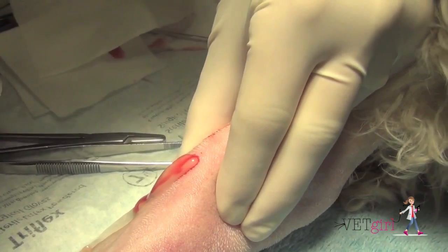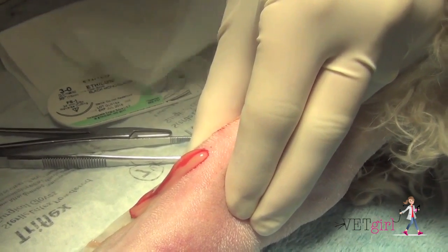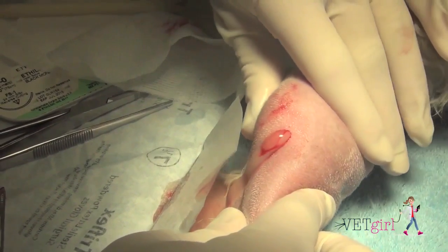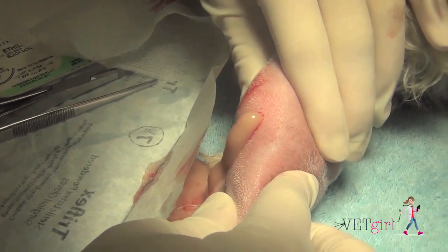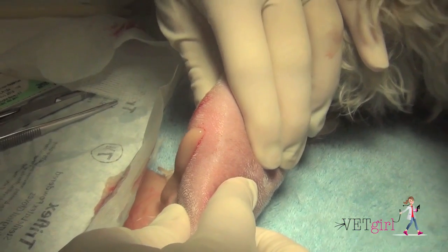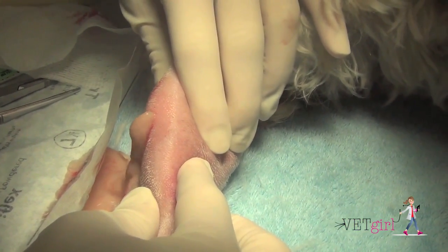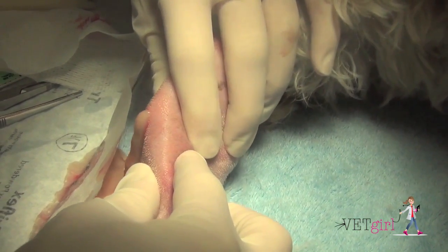We sedated the dog and using local anesthesia, which consisted of lidocaine, and sterile technique, we went ahead and made several stab incisions in order to create an opening to allow for the pus to drain. Thankfully, this one was quite rewarding, as you can see from the purulent discharge coming out of the stab incision.